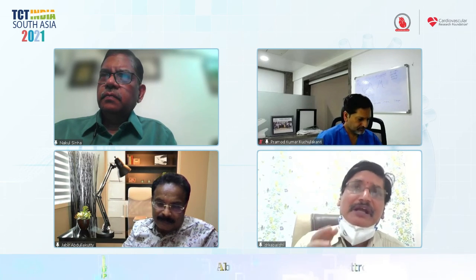And see, this is the natural history, but here it looks relatively not so hard, and it yielded to a higher size routine NC balloon, even the OPN balloon also. But during this process, we lost one balloon to rupture because of the eruptive nodule with spicules. It is fortunate, but the haziness of the lesion made me a little bit overconfident. It is a Shepherd Crook, not mild but a severe Shepherd Crook.